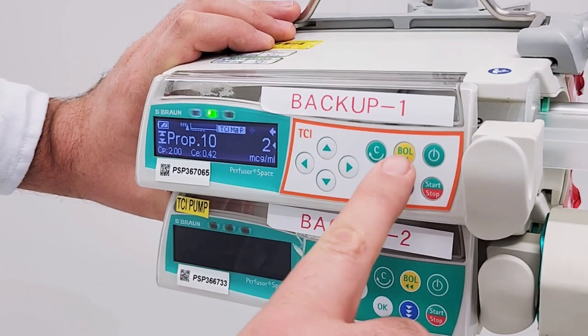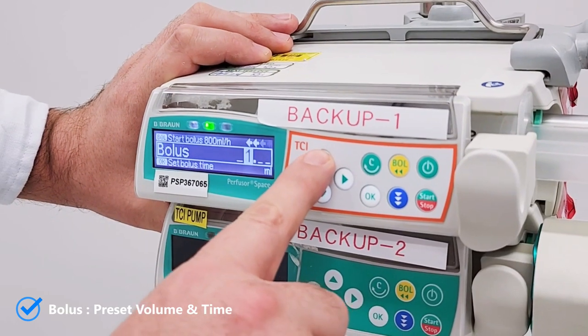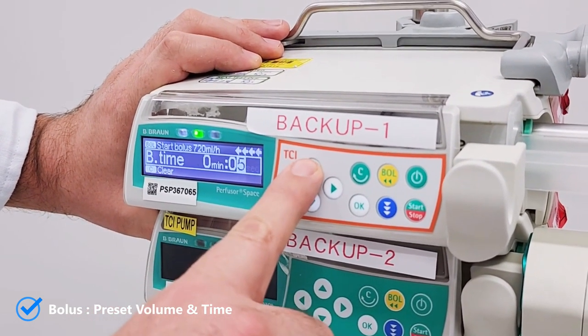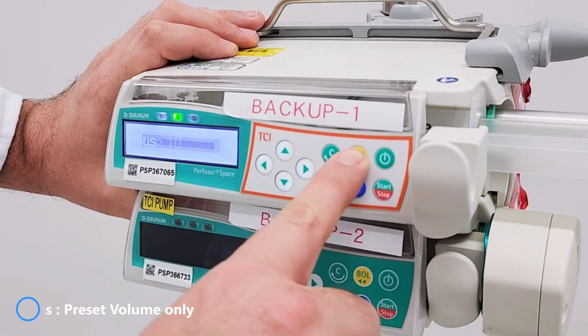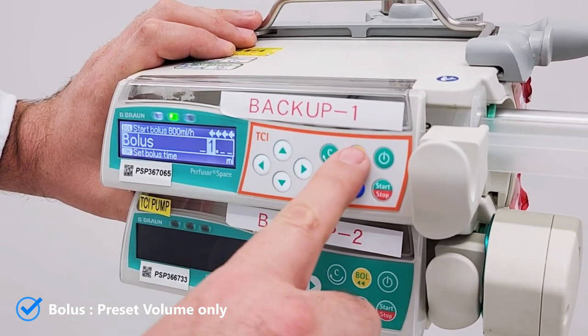There are three ways to give bolus. The first way: press bolus, set the amount by using the arrows, press OK to confirm and set time, then press bolus again to start. Or alternatively, press bolus, set the amount by using the arrows, then press bolus to start.